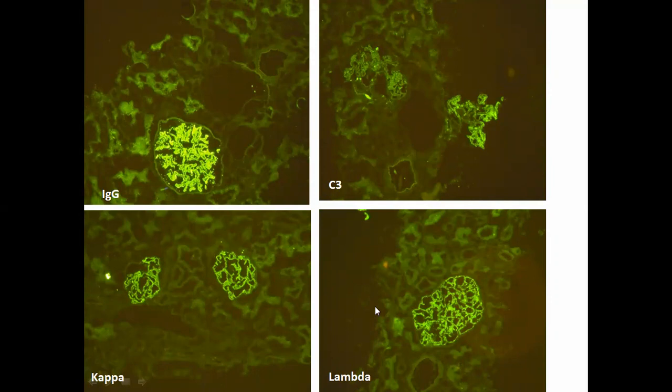Kappa and lambda is showing equal staining. That means there is no light chain restriction. This is a classical immunofluorescence pattern of a membranous. I would say a primary membranous, where you find IgG, C3 which is trace, and kappa lambda which is equal. So kappa lambda equal means that there is no light chain restriction.